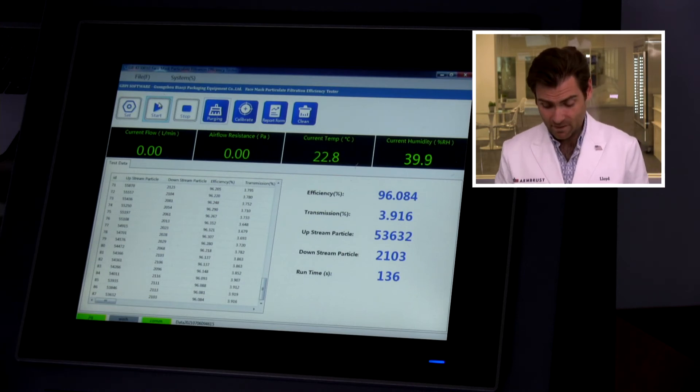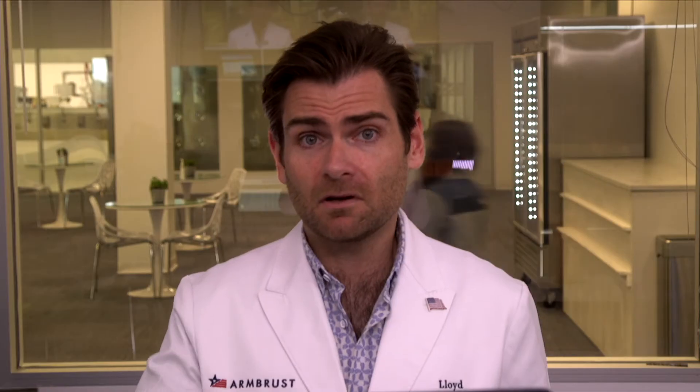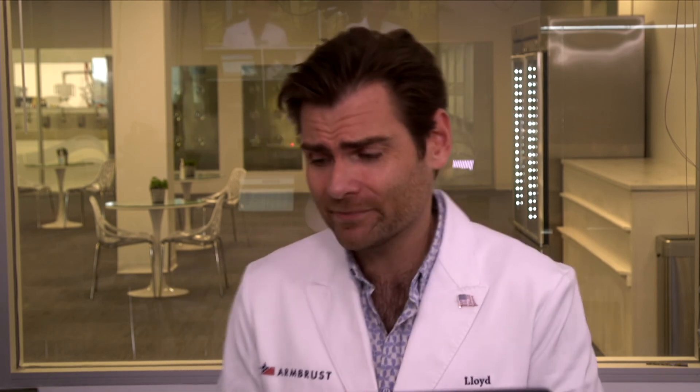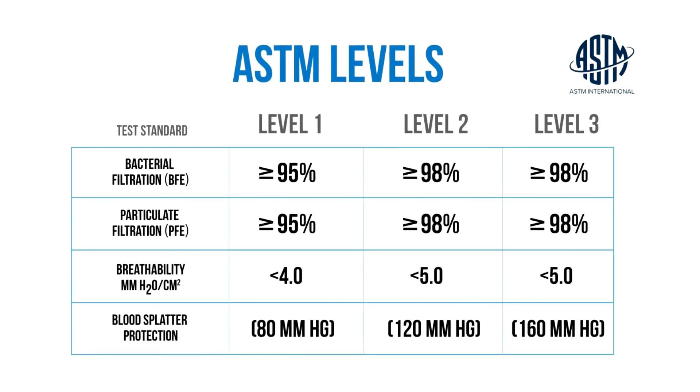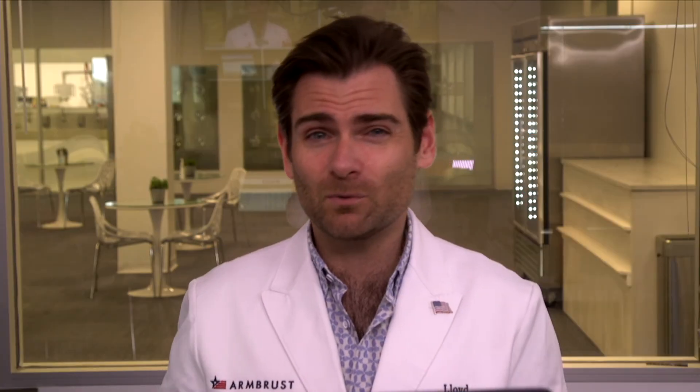Not bad. In fact, so far in India, this is the best mask we've tested — 96.084%. Pretty good. Type two doesn't really specify for PFE, so I can't really call them out on that. They are saying 98% on there, and I do feel like it's a bit misleading — you're going to think that's going to protect you 98%. I like to look for ASTM level one, or personally level two or three, which gives you 98% or better. That's the American standard. The European standard is a little different. But this is a pretty good mask — I'd give it to them.